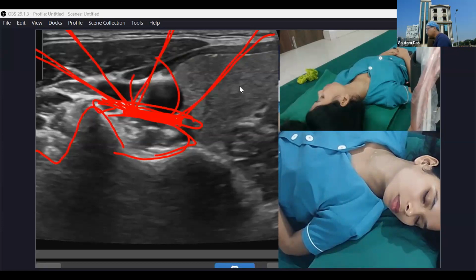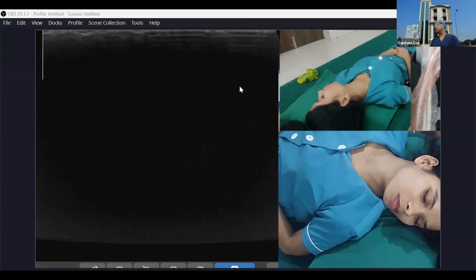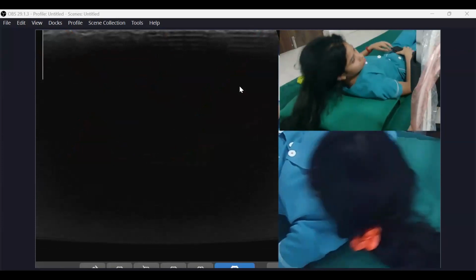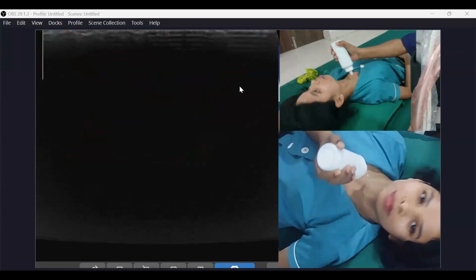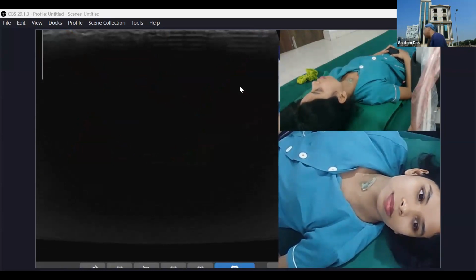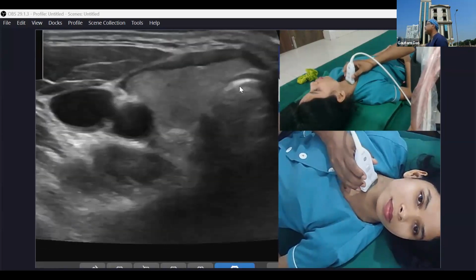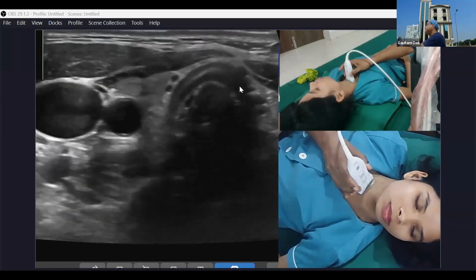Right? The stellate ganglion cannot be seen by the ultrasound because it is a thin plexus of nerves. It is not appreciated. So now, Sir, injecting about 10 cc volume is good. If you are injecting at the level of C6, then your volume should be around 8 to 10 cc. But if you are injecting at the level of C7, then 4 to 6 cc is enough. Okay?